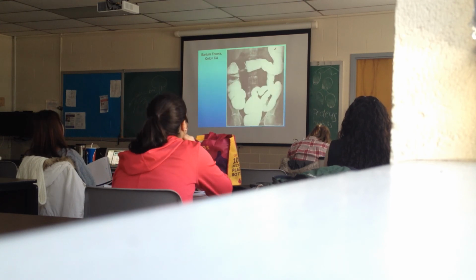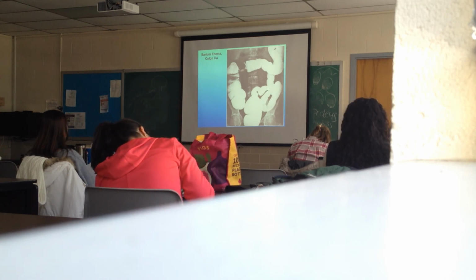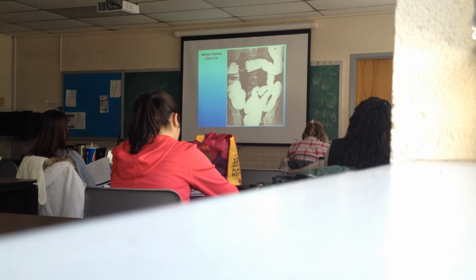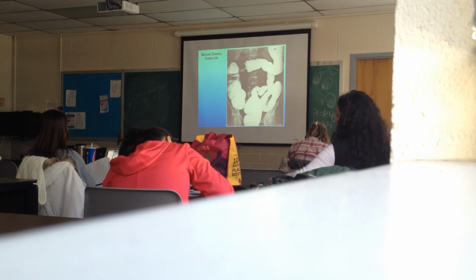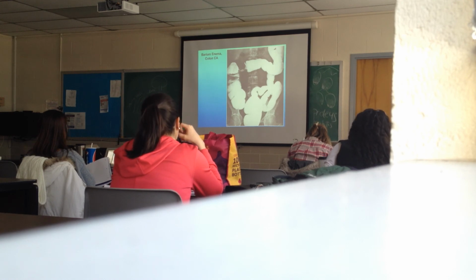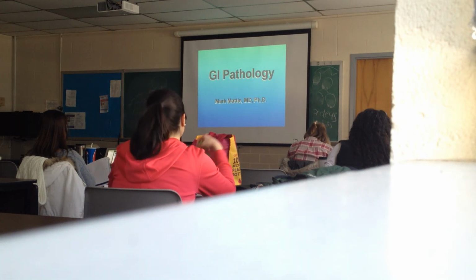Okay. Wow, look at that. Redundant sigmoid. Filling defect. How would you describe that filling defect? Apple core. Yeah, it's a cancer growing in an annular distribution. Apple core lesion, or apple core filling defect.